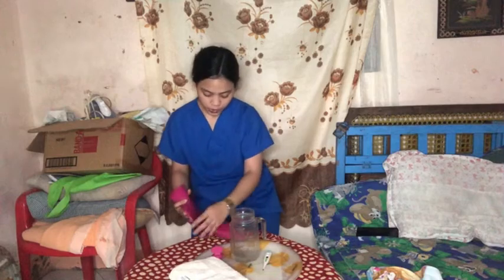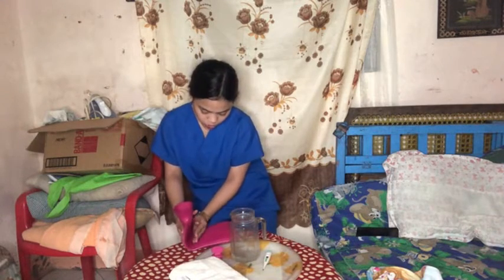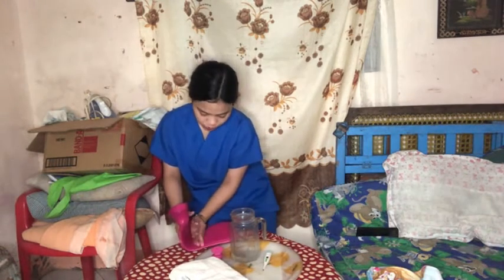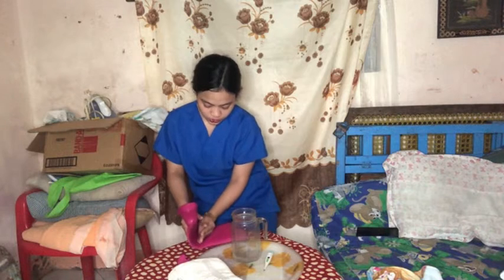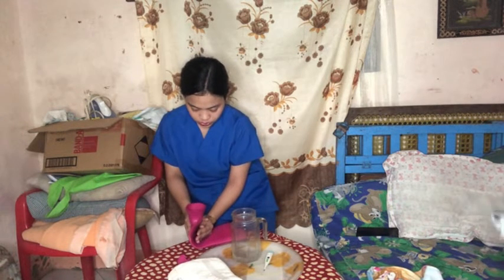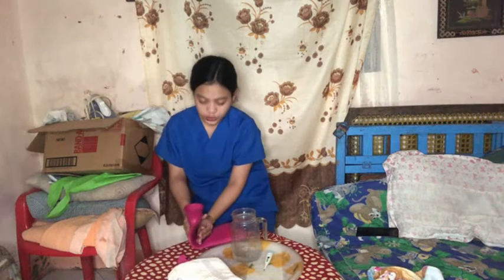We're just going to fold this body part of the hot water bag to expel the remaining air.